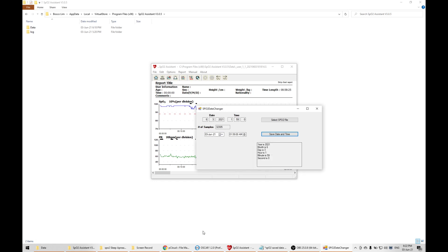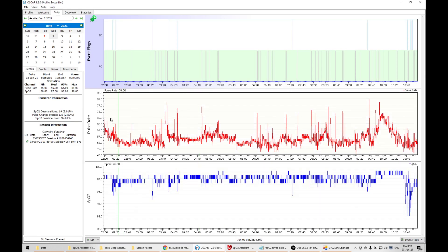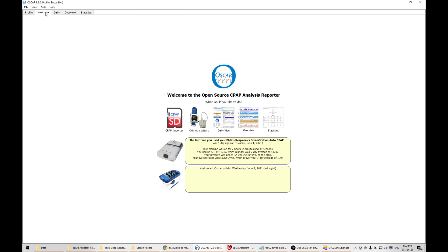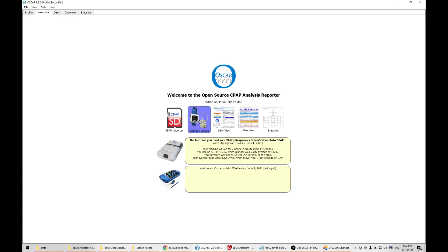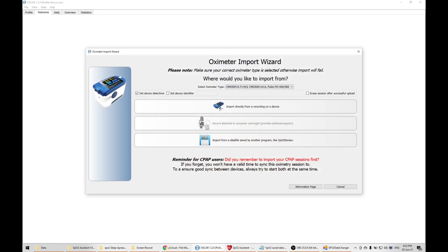If I go to this OSCAR app, which is a sleep apnea app, I go to Welcome. Make sure you only click the oximetry wizard after you've imported the data, otherwise it may mess the data up.